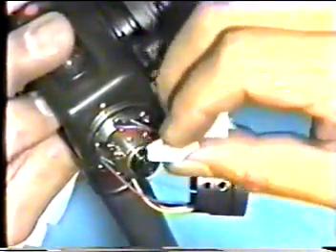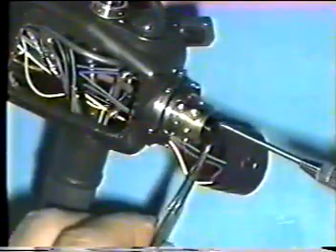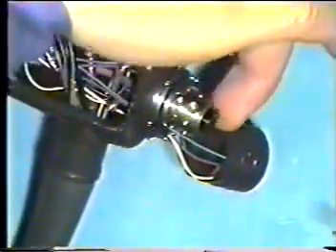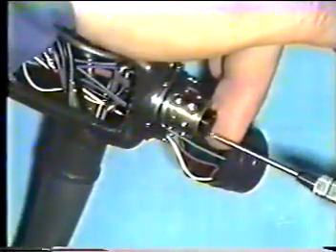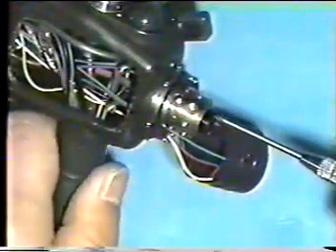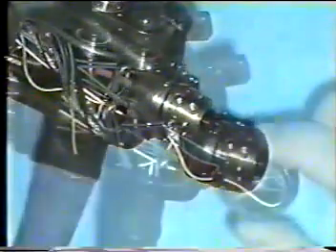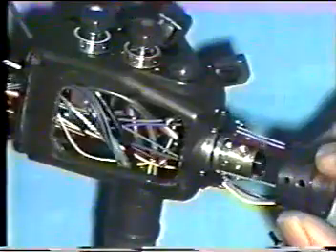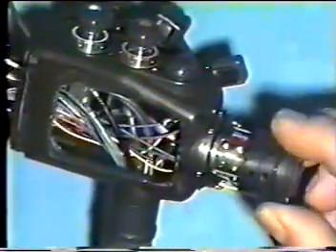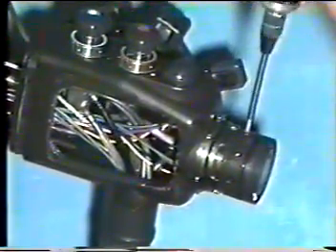Clean the surface of IG. Attach the iris with 2 screws. Mount CGA on the main body without twisting cables. Fasten 2 screws.